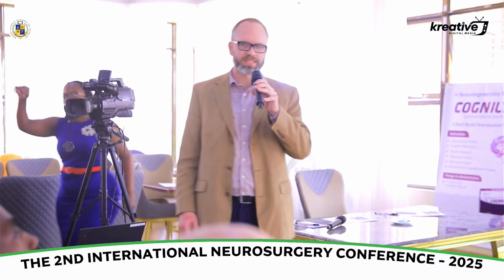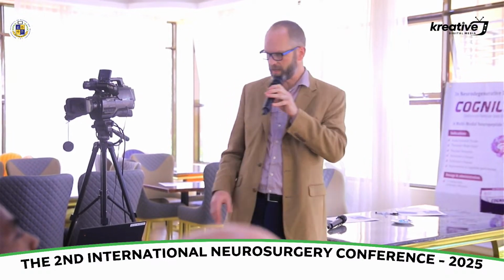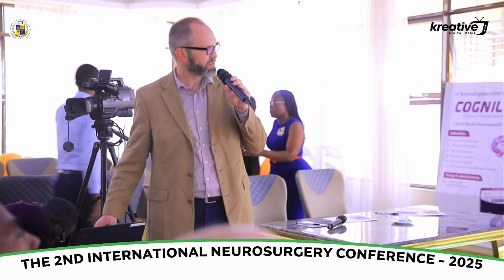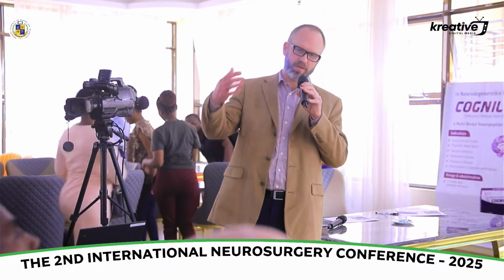If we go to C mode, this uses data and range of depth from the A mode and transitions to B mode to examine the whole region at a depth originally employed in the 2D imagery. Also, it's used more in cardiac surgery. Same with M mode, which gives a time factor. And Doppler comes back to being relevant to neurosurgery.